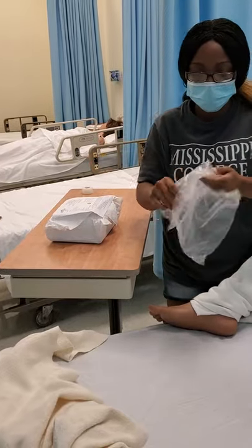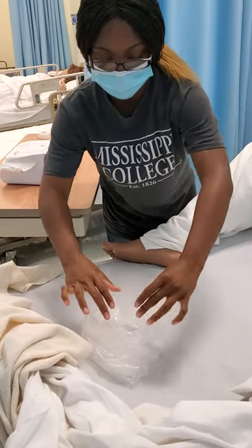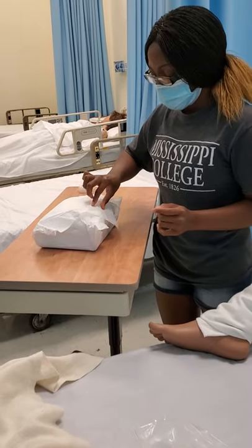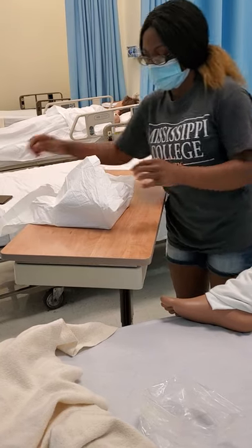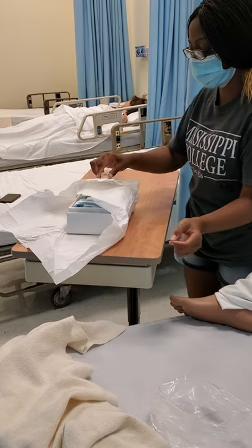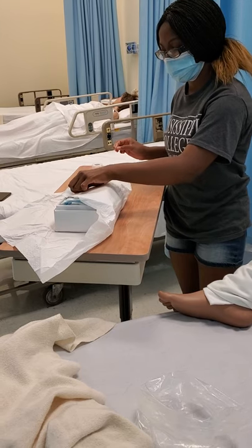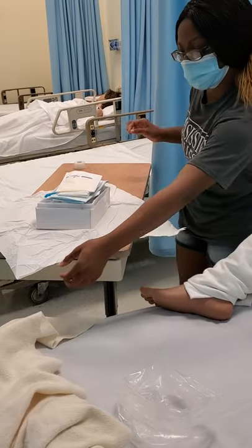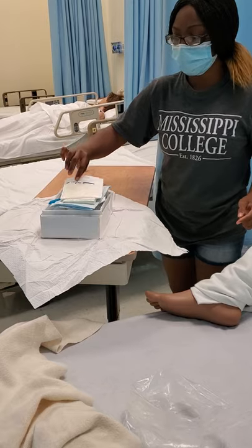Alright. And I'm going to fold this down so that I can use this to throw stuff away. Okay. I don't need this, so I'm just going to discard it. Now I'm going to. Staying within my 1-inch border. Okay, now I'm going to don my sterile gloves.